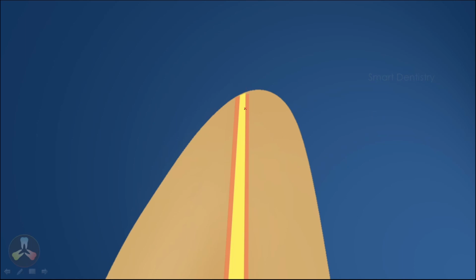But look at both sides of the master cone. There is a canal which is empty. So this area is going to be filled with the root canal sealer, and the root canal sealer, if it comes in contact with any liquid like the periapical tissue liquids, it will get dissolved within a month or 2, and it is going to leave an empty space. Even if you are doing a lateral compaction, the accessory cones may not reach up to the root tip. So this situation, it is going to fail definitely.